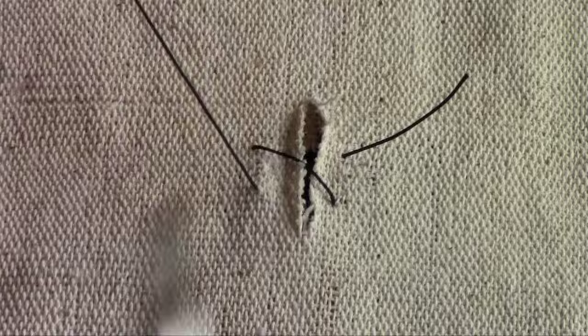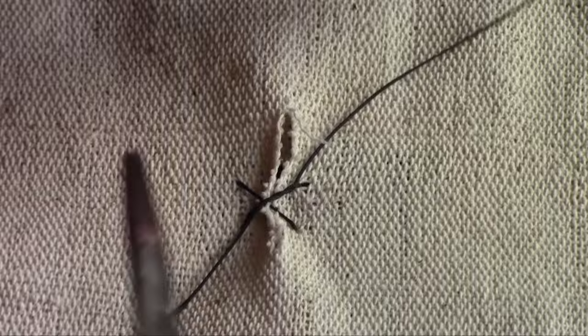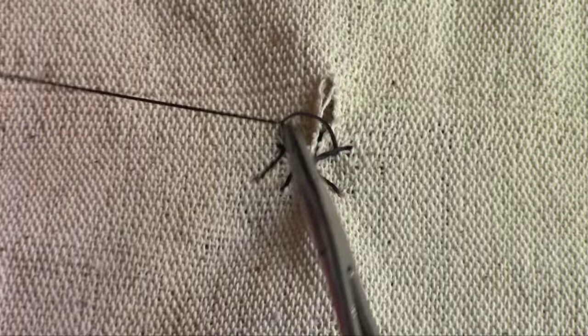Pull on all sides to make sure that the vessel stops bleeding. Then, throw your instrument high once you've determined you're in the right place. Secure it well, making sure that the entire vessel is controlled.